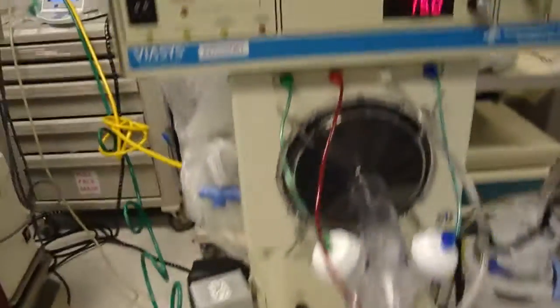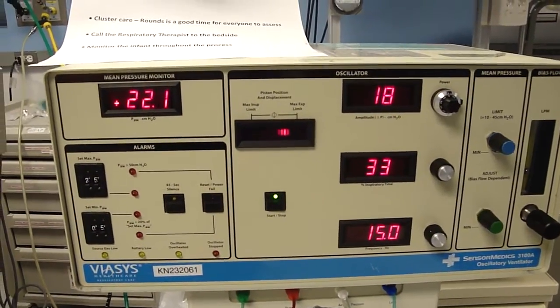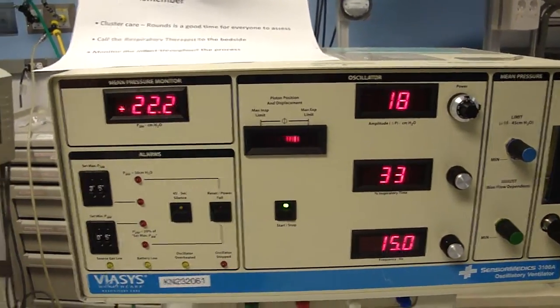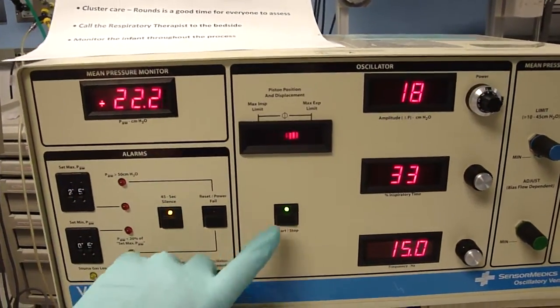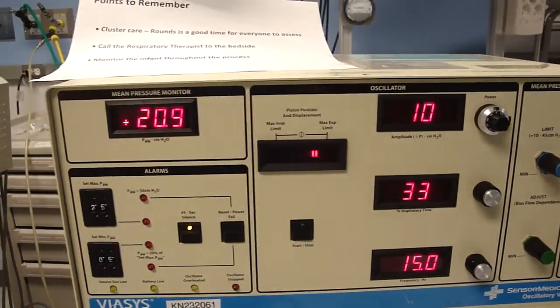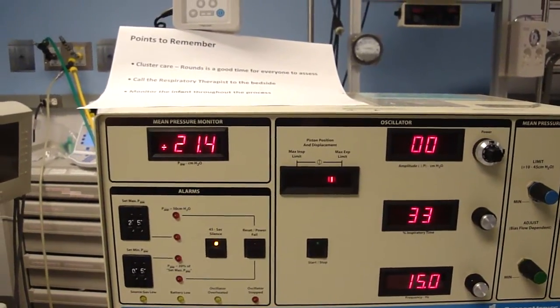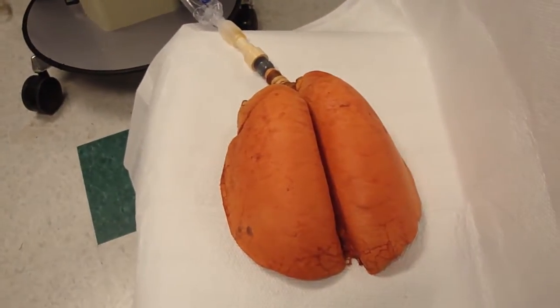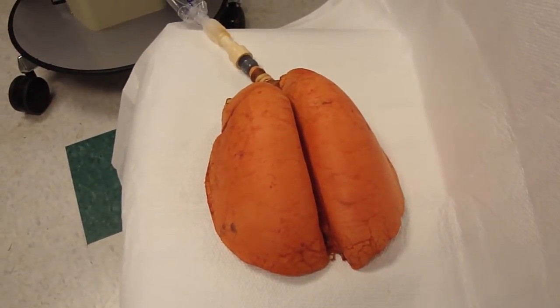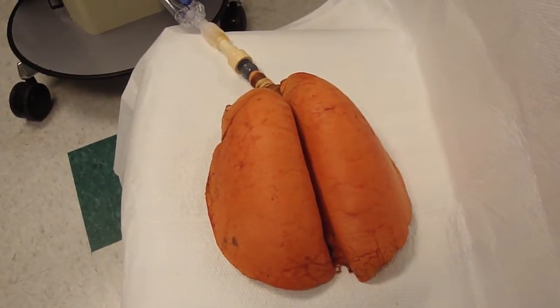Make sure that your respiratory therapist is present. The respiratory therapist will silence the alarm and then will stop the piston. This will allow time for those that need to listen. Stopping the piston maintains pressure in the circuit and the lungs will remain inflated. This will give you approximately 30 to 40 seconds for those present to auscultate.